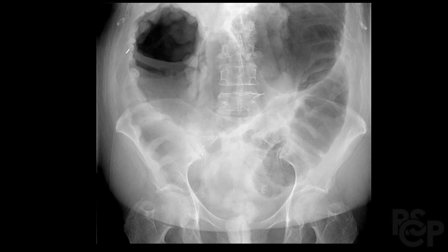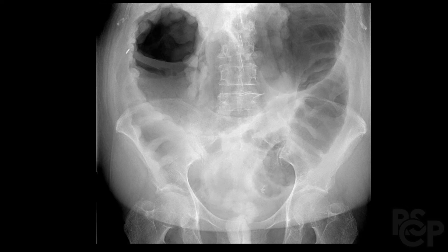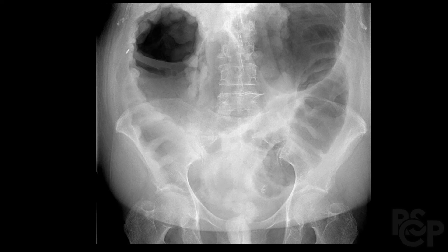This is another case of pathology you can see within the GI tract on a KUB. This case shows marked distension of the transverse colon with nodular appearing wall thickening. This was a patient with toxic megacolon secondary to C. difficile colitis.